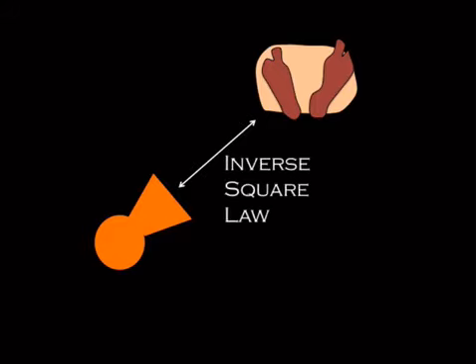All right, so we'll get into some of the trivia here. It's important to understand that the measurement is independent of the beam location. Now, it's true that as you move the beam away from the patient, the intensity is going to decrease.